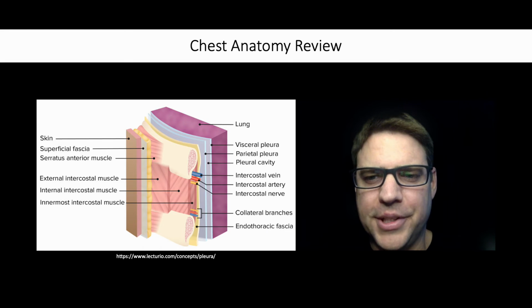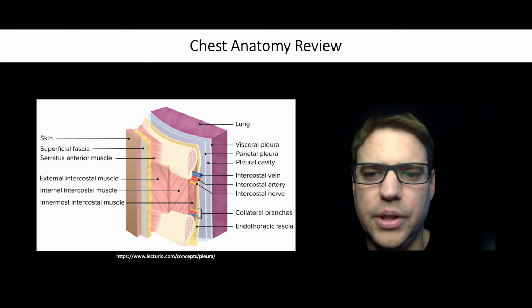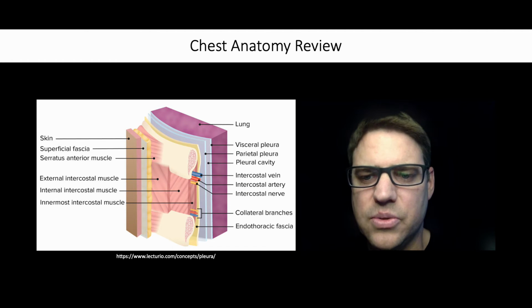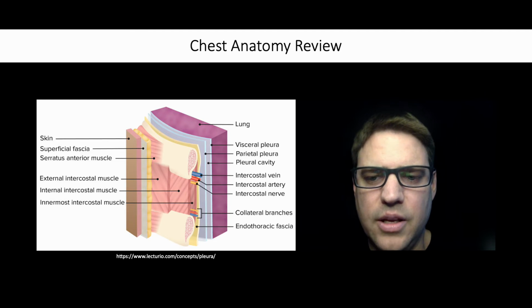When performing a lung POCUS exam, it helps to keep in mind the anatomical structures that will be assessed. When a POCUS transducer is placed perpendicular to the chest wall over the intercostal spaces, its ultrasound beam travels through several layers of body tissues, including the epidermis and dermis, subcutaneous tissues, superficial fascia, deep adipose tissues, deep fascia, external skeletal muscles, external, internal, and innermost intercostal muscles, endothoracic fascia, parietal pleura, visceral pleura, and then into the lung tissue.